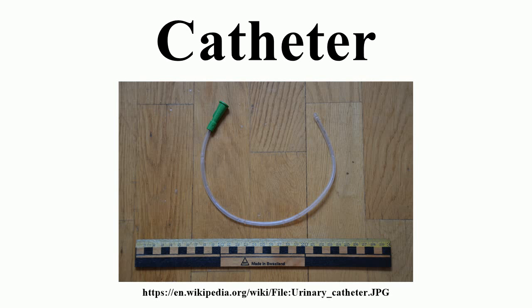A central venous catheter is a conduit for giving drugs or fluids into a large bore catheter, positioned either in a vein near the heart or just inside the atrium. A Swan-Ganz catheter is a special type of catheter placed into the pulmonary artery for measuring pressures in the heart. An embryo transfer catheter is designed to insert fertilized embryos from in vitro fertilization into the uterus. They may vary in length from approximately 150 mm to 190 mm.